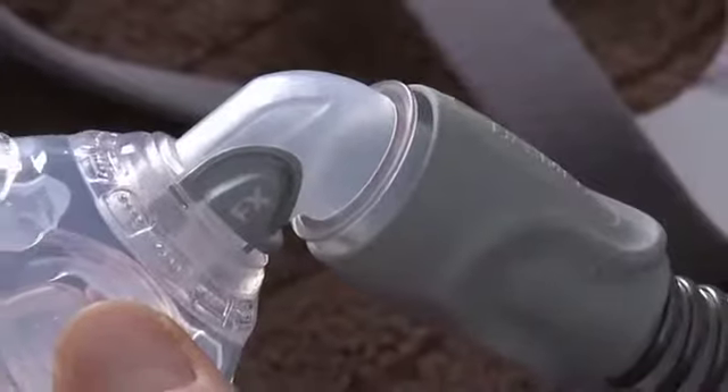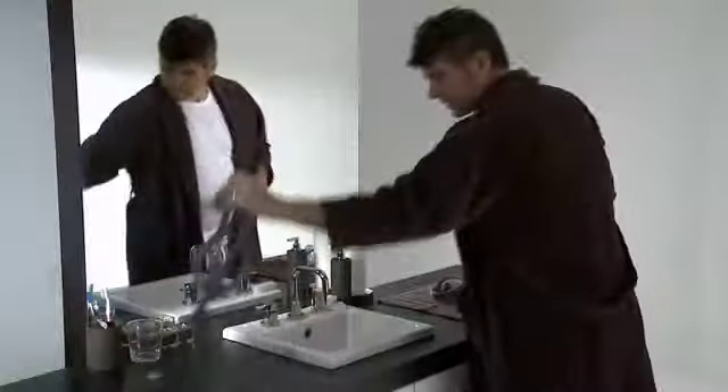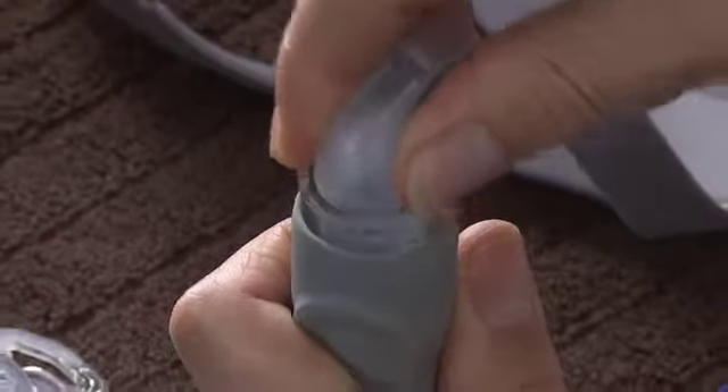Remove the combined elbow and air tubing from the mask by pressing the side tabs and pulling away from the mask frame. Then remove the elbow from the air tubing.